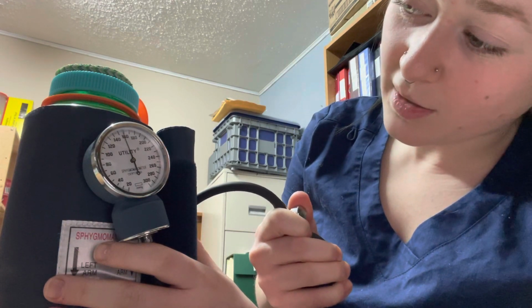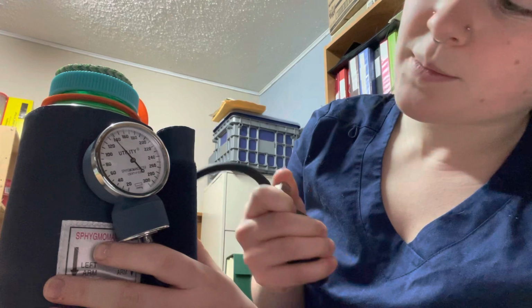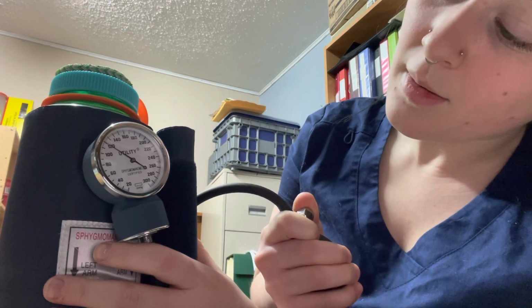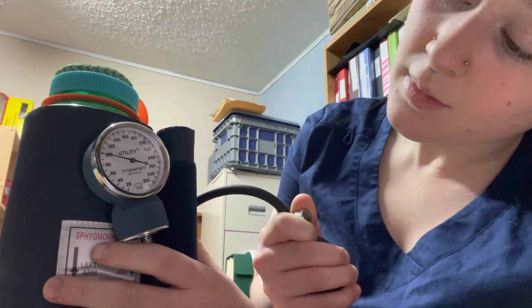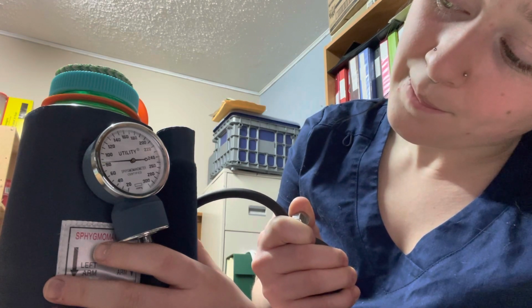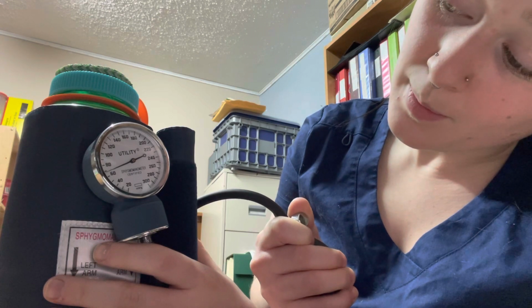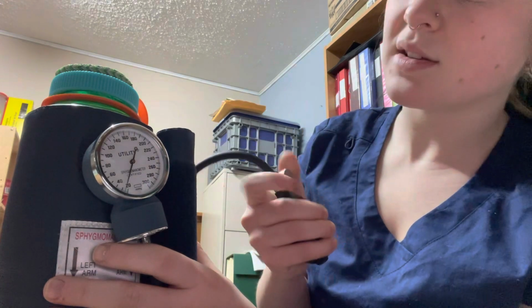And I'm going to slowly let it out, making sure that I'm not getting any sudden droppings, because this can cause me to possibly lose the sound. But that's more important for the second step. I'm going to let it drop slowly to 60 millimeters mercury. There we go. All right, and then I can release the valve. Okay, this would be the value, like the number when I can no longer feel the pulse.